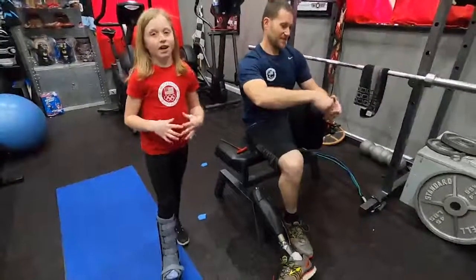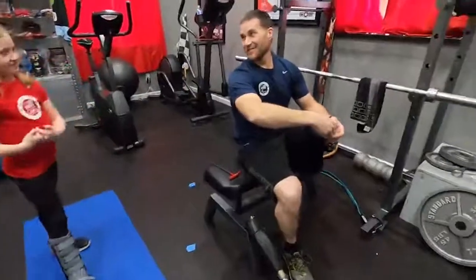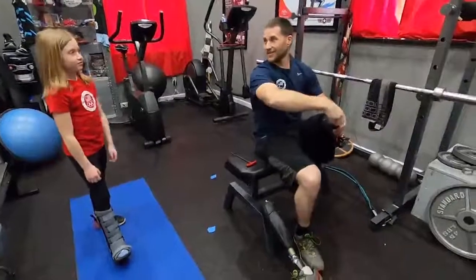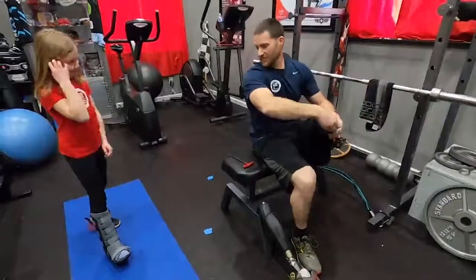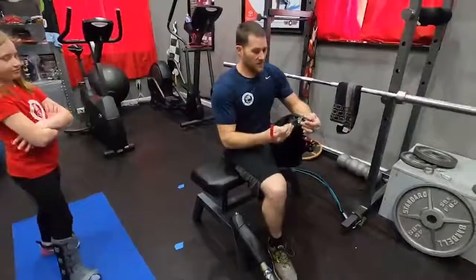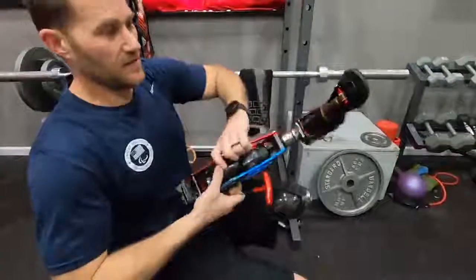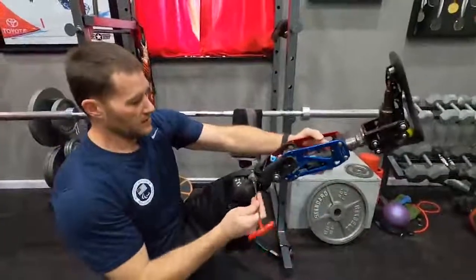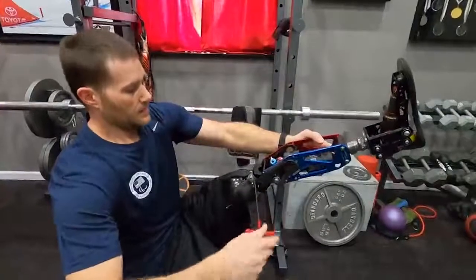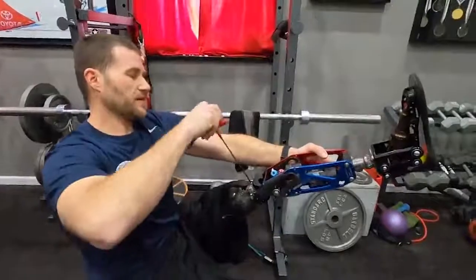If you're wondering why Lauren has this foot on — she's actually a really good gymnast, and she kind of broke her ankle. It happens, doesn't it? First break ever — no fun, but at least you're not in a real cast. Right now I'm swapping out the adapters to put my moto knee on. This is the adapter that Lauren was putting on that mini moto knee a minute ago.